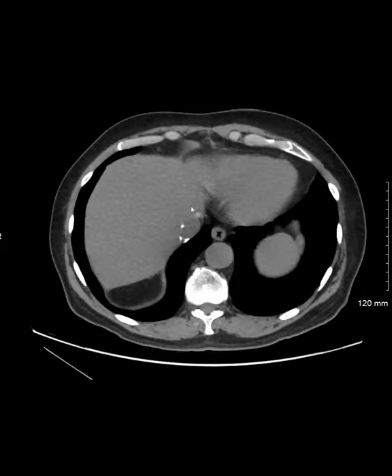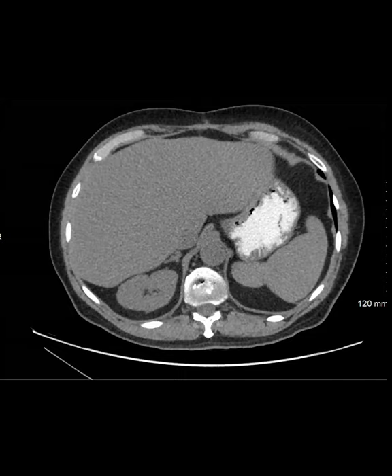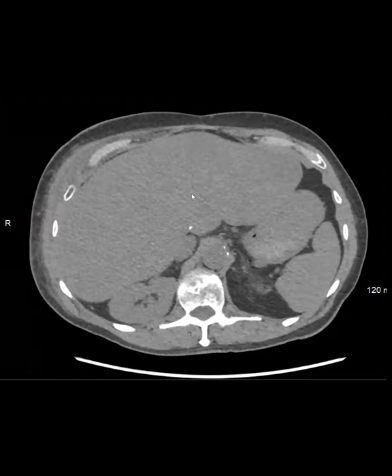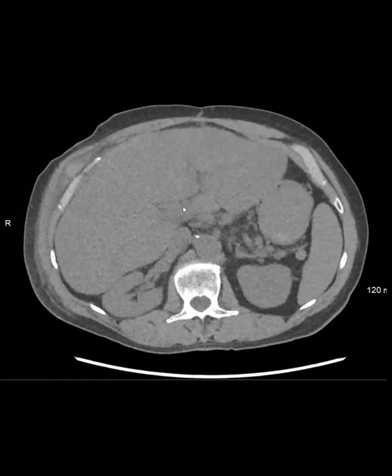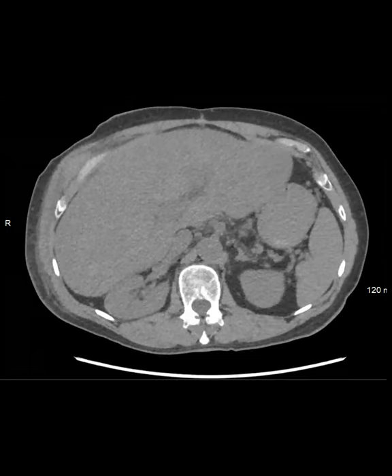He has a transplant on, we have no contrast enhanced studies. Anyway, he came back this past month. He came in for something unrelated. He was short of breath, and they were concerned about PE, and just threw this in as a fun study. So now you can see his liver looks much more heterogeneous and is enlarged. Based on this, we recommended that he get a contrast enhanced study. And this is his MR.